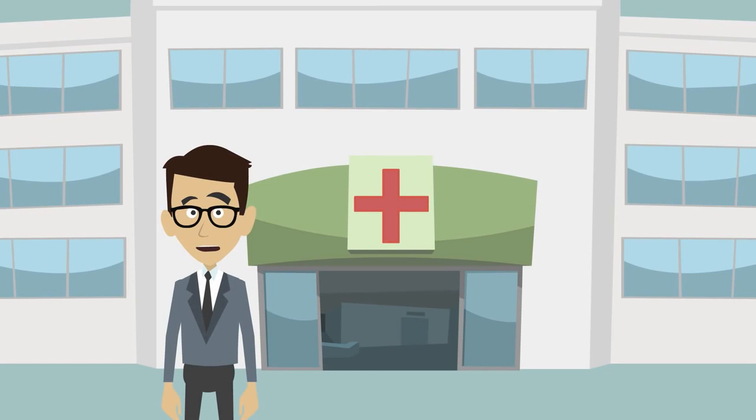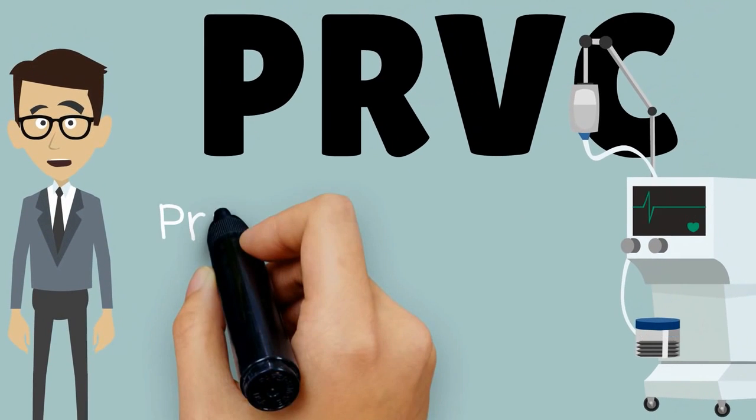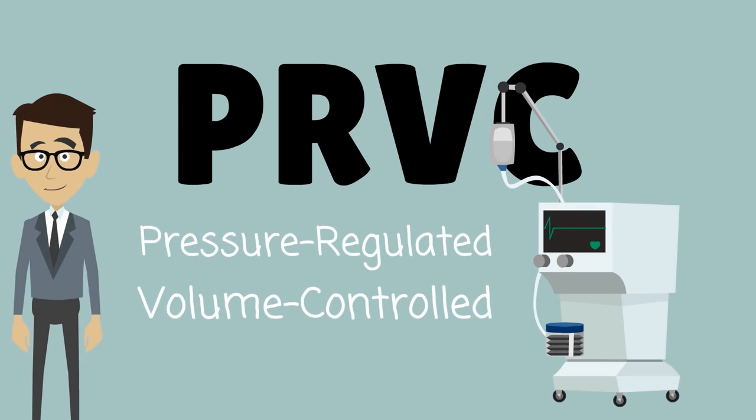There are many ventilator modes to help patients breathe. PRVC is a great mode of ventilation to manage and treat patients on a mechanical ventilator. So let's look at pressure-regulated volume control and see what sets this mode apart.